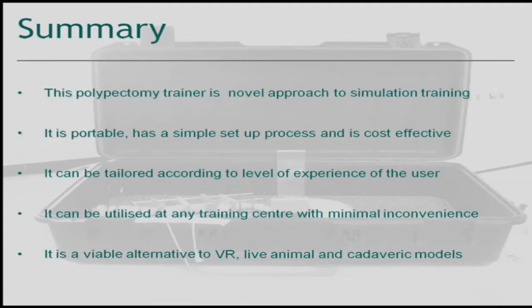In summary, this polypectomy trainer is a novel approach to simulation training. Its benefits are that it is portable, simple to set up and use, cost-effective, and it can be tailored to the experience level of the user. It is therefore a viable alternative to virtual reality, live and cadaveric simulation training.